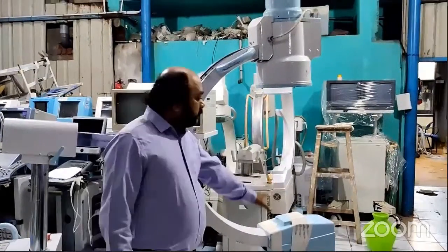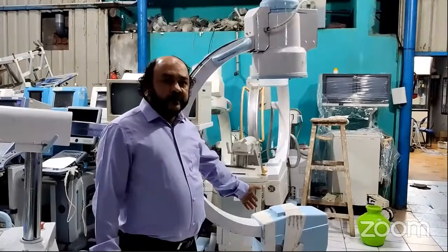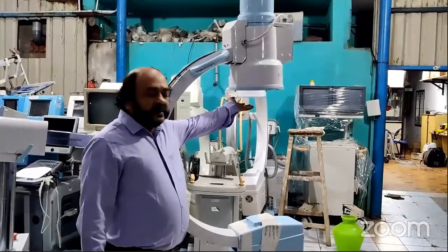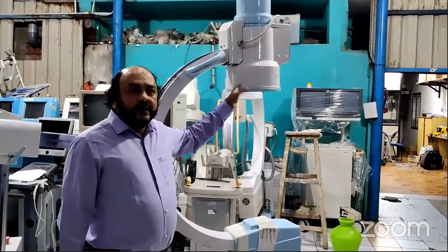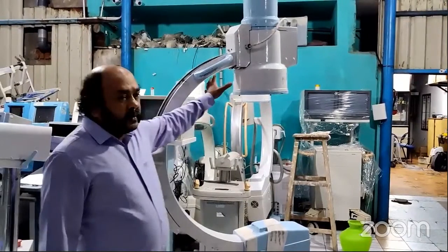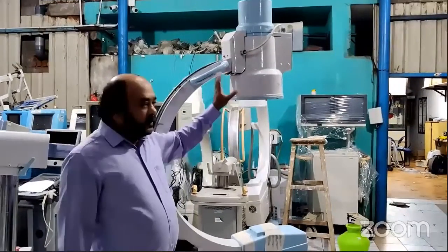Once X-ray is generated by the tube, it passes through the object, meaning the anatomy. Then it will be captured by the image intensifier and converted into the image. Understood? So this is the IA. Anyway, we will open and see how that IA works later. Before that, I am just giving you the idea of what is what.